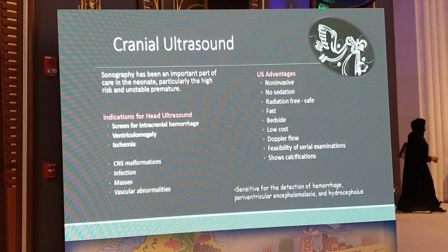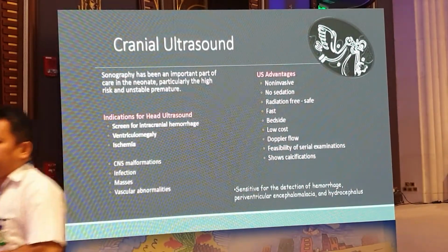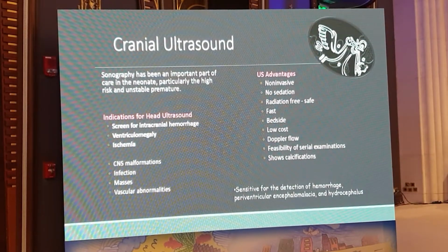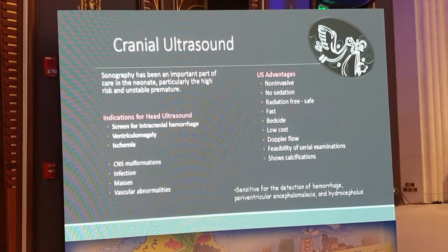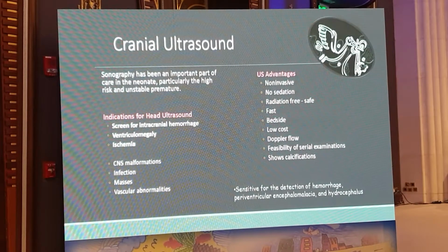The advantage of ultrasound, of course, is that it is non-invasive, easy, needs no sedation, is fast at the bedside, and is cheap. There is no radiation, so basically it is safe, and serial or follow-up examination is feasible. It can show calcification, but it's definitely very sensitive for hemorrhage and sometimes periventricular encephalomalacia and definitely hydrocephalus.